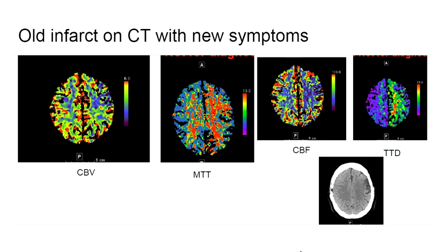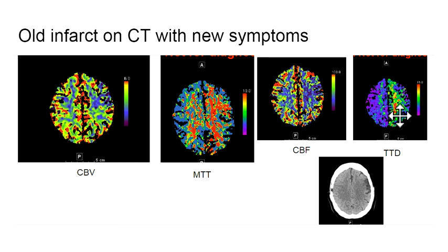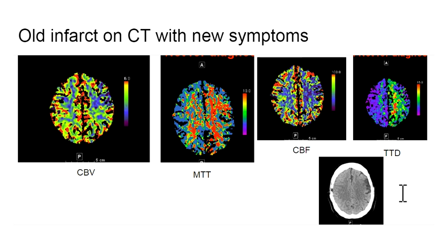This patient came into the ER with new symptoms but had an old infarct on non-contrast head CT. The first thing to do is look at all the sequences and find the abnormality — there's a big abnormality on the time to drain. Then analyze by comparing CBV to MTT: there's a large MTT defect and a relatively small CBV defect, corresponding to the CT findings. You would say there's a relatively small core infarct with a large amount of surrounding potentially reversible ischemia throughout the left hemisphere. The CTA showed a left internal carotid occlusion.